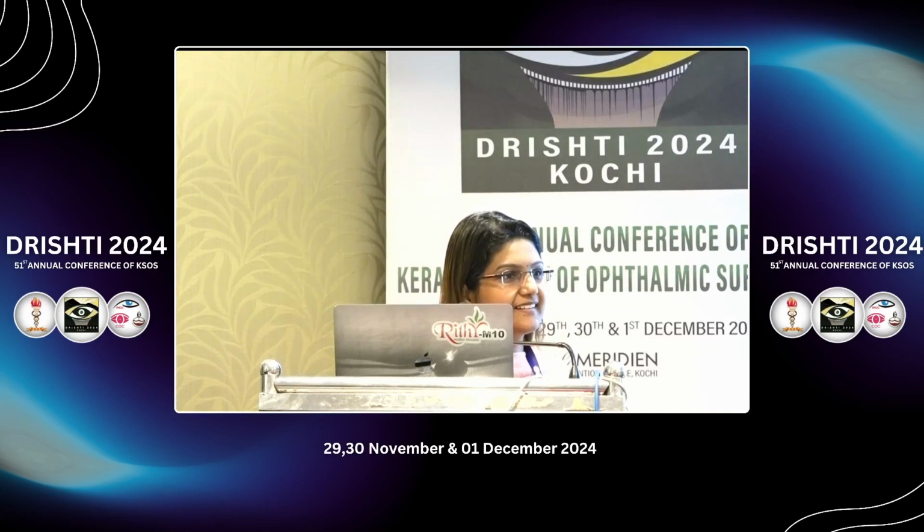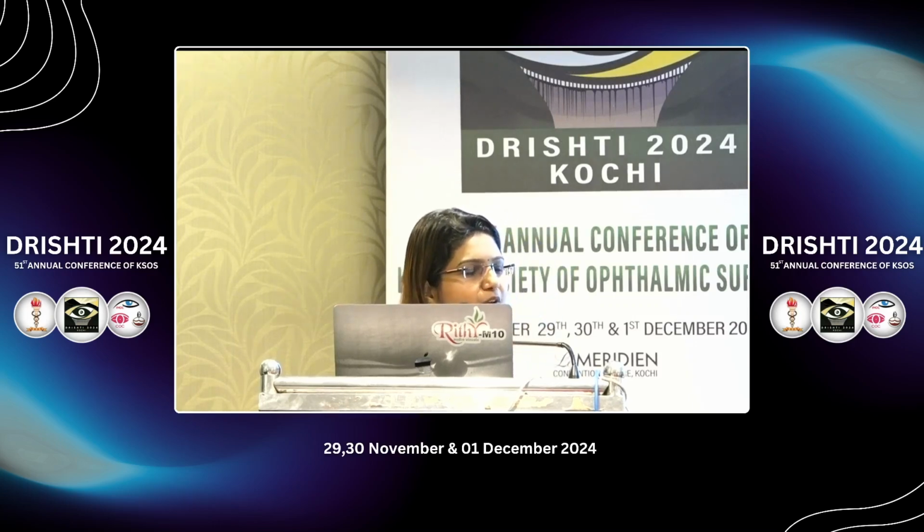Any other complications during surgery? Anything like that? Actually, post-operatively? No such complications, sir. Only one patient was complaining of intermittent glare, but that patient had a very dysfunctional tear film also. So at times it was just intermittent glare, sir. And any patients who were systemically having diabetes or something like that? Yes, sir. Patients had, but they did not have any difference, sir. It was like normal patients.